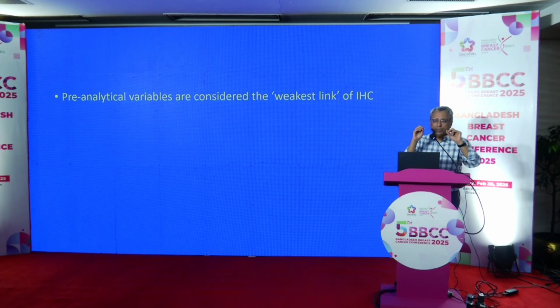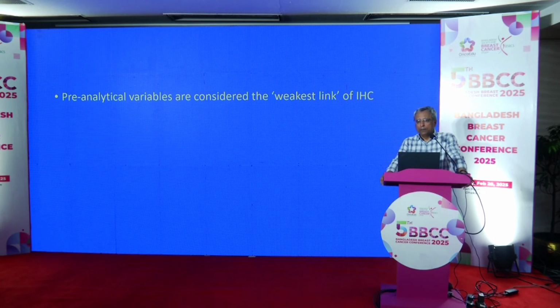Although it sounds like a very basic thing, that is actually a very critical point where a lot of times, even in very organized labs, they can make that mistake. So you need to be careful about matching the patient sample with the patient. So patient identifiers become very important, like date of birth, national ID or registration number. These need to be matched.